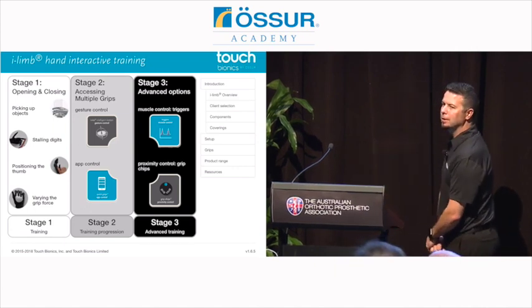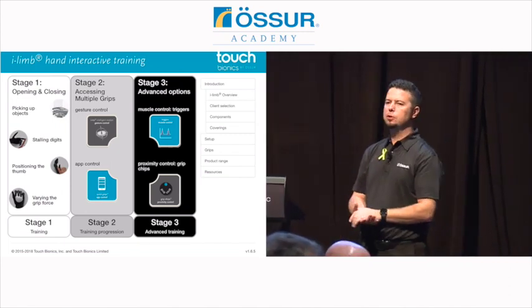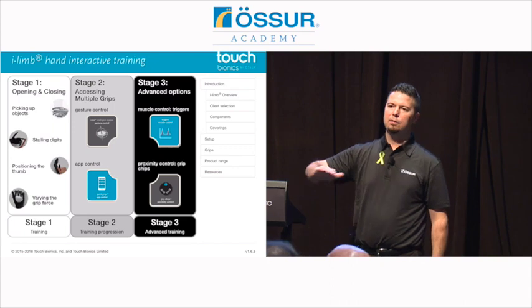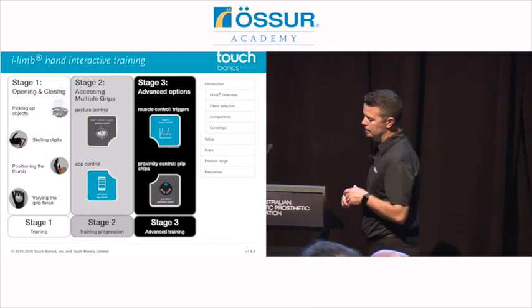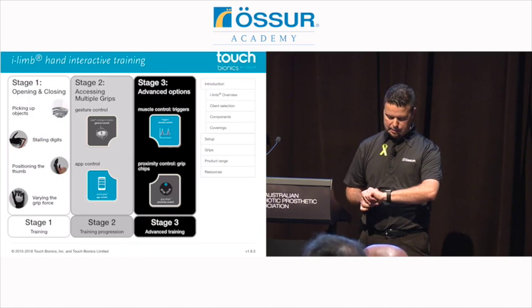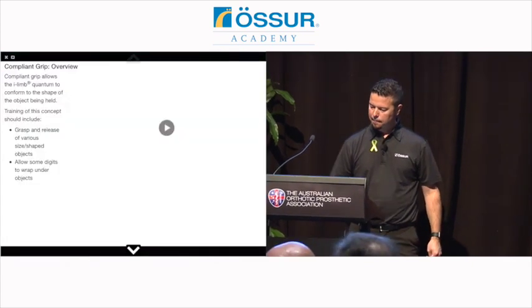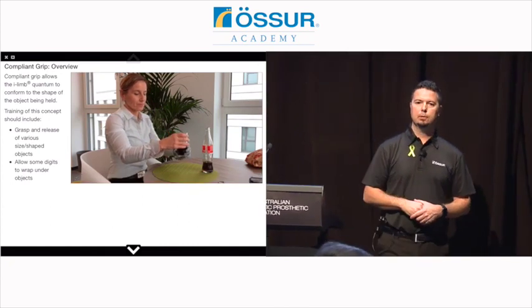All right, so what we're going to do is I'm going to have Nathan run through a few of these stage 1 features and benefits, these things that you want to teach somebody. So even though he's a proficient user, we're going to start from scratch, and the things that we would show him if this was his first time being introduced to the technology. And in stage 1, what we cover when you're teaching a new user is things like picking up objects. How do they do that? And each one of these is a clickable hyperlink that we can actually look at videos, pictures, examples.